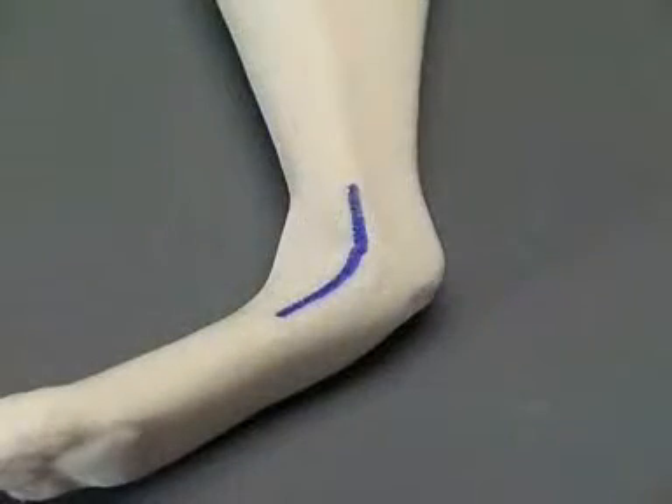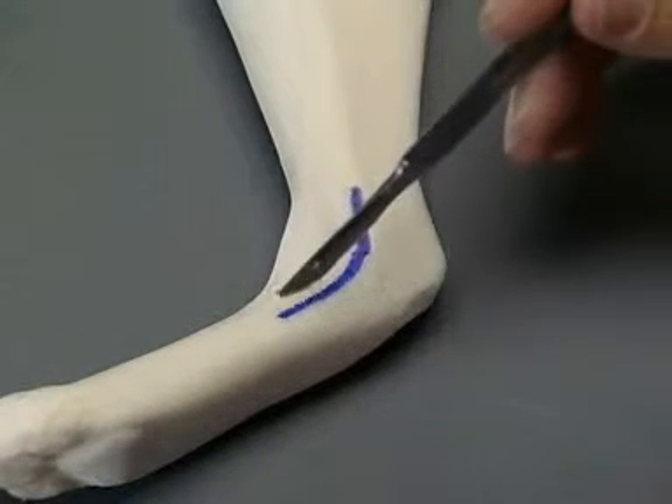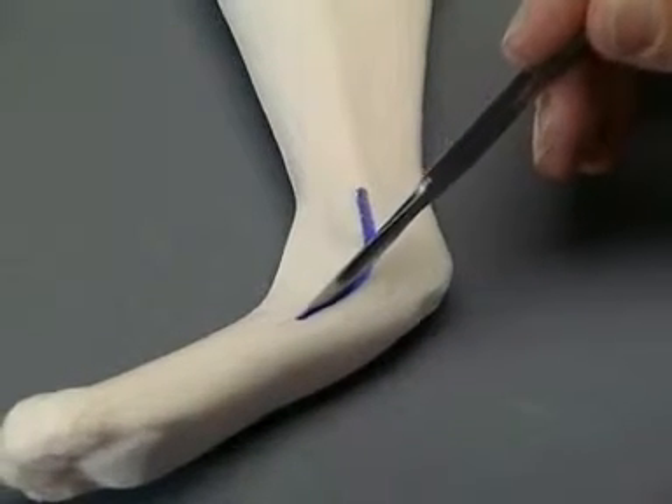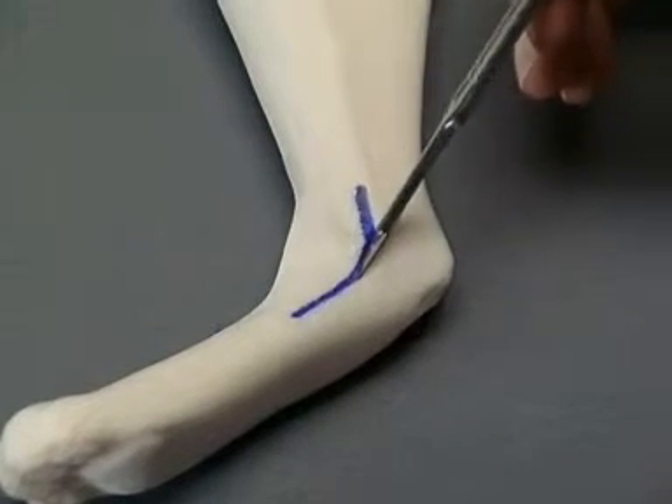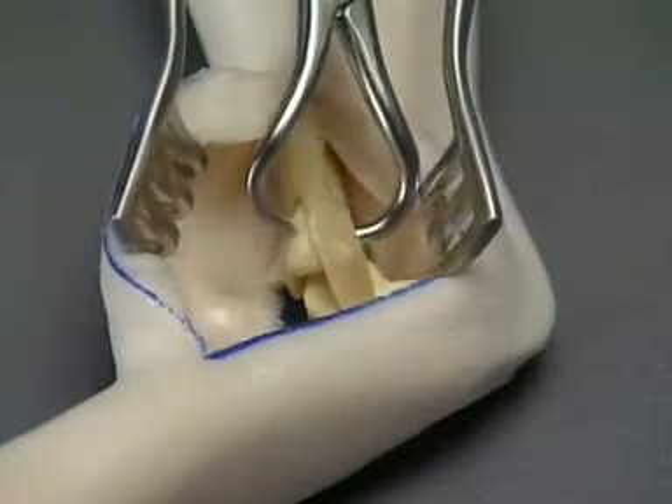The landmarks for the repair of the lateral malleolar fracture are the distal fibula and the lateral metatarsal bones. The foam is incised on the lateral aspect of the talocrural joint. The fracture is reduced.